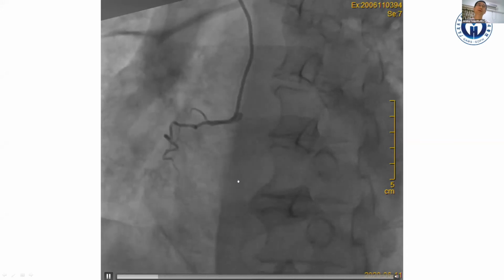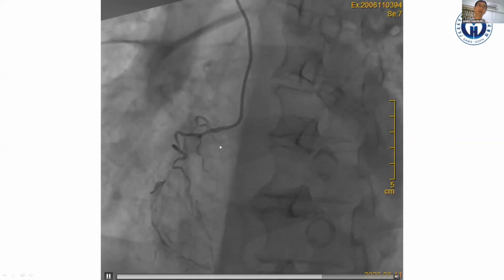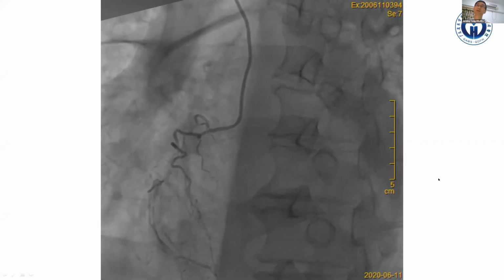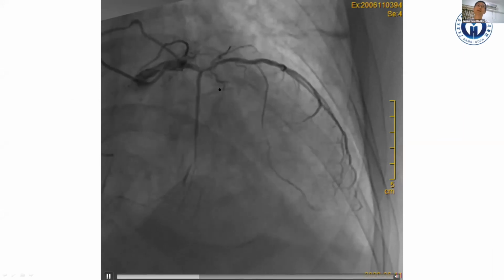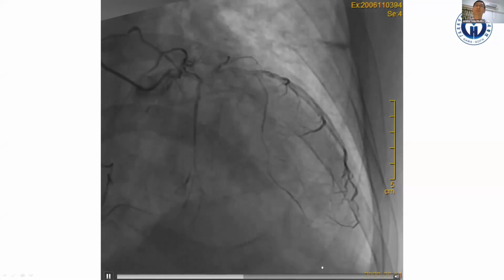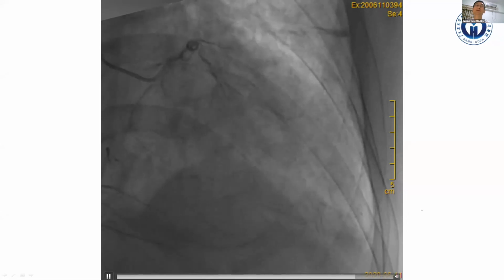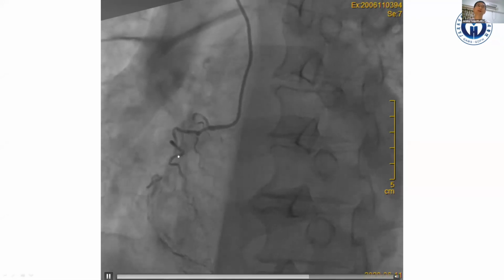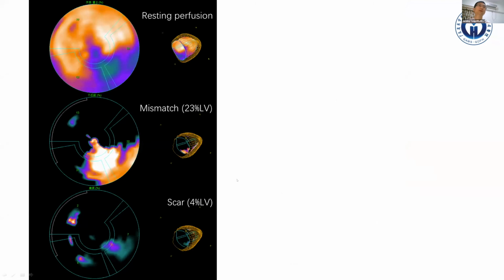With the angiogram at the very first, I already had some idea. I think to recanalize the right coronary should be the first choice. Compared with the LAD, we can see the LAD is also calcified, but quite long occluded, and the distal vessel is not clear. And it's quite small. So if I have to do PCI for this patient, the right coronary should be the first choice. And according to the PET, the ischemia area was contributed by all of the right coronary, circumflex, and LAD. So to pick up the right should be the first choice.